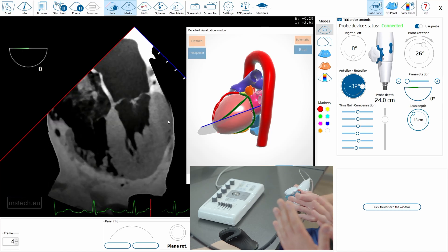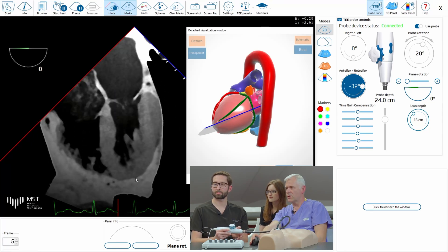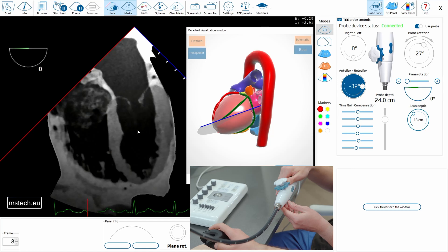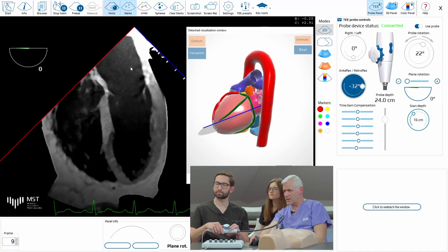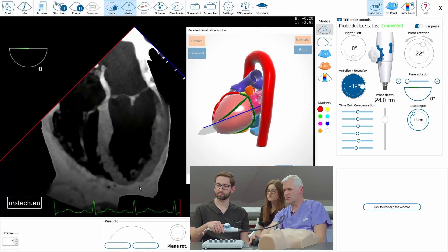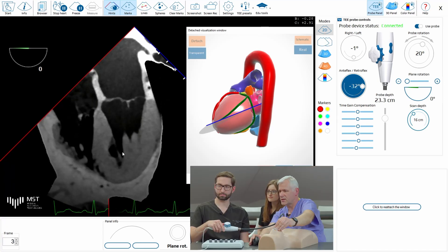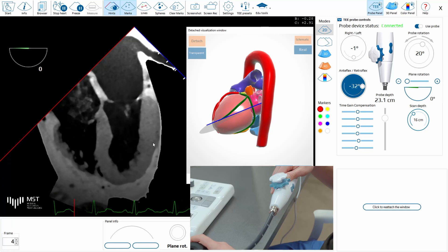Position the heart in the center of the sector. Now we will be changing the angle, rotating along this line — keep the left ventricle very vertical in the center, which is very important. We'll go to 60 degrees, but first notice the four-chamber view: a very nice four-chamber view with the true apex, almost not moving. With a slight modification you can see the right ventricle, right atrium, and left atrium.